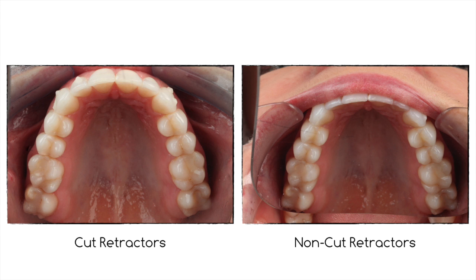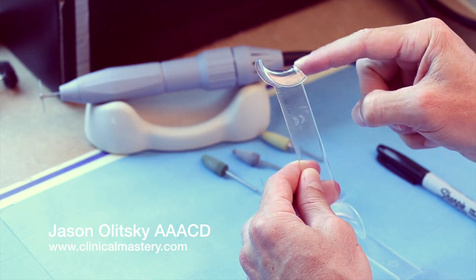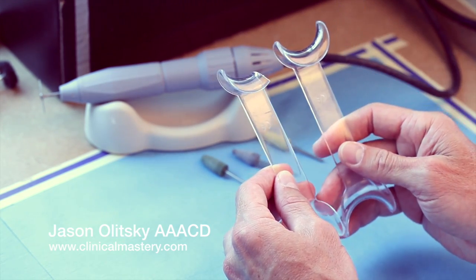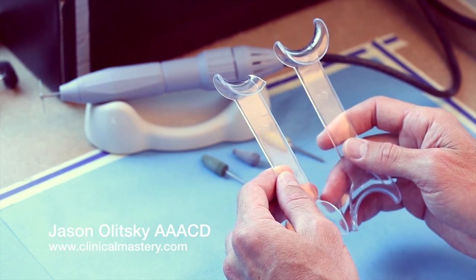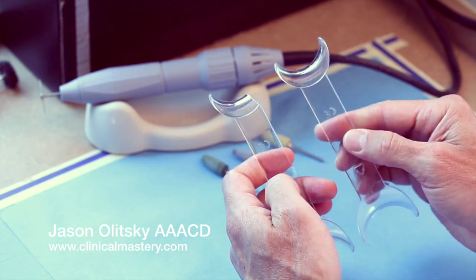This is the way I do it. I have one cut already — you'll see one arm has been cut off. I'm going to do another retractor so that there will be a set. You have to make sure that you cut the right side; you don't want to cut the same side on both retractors because then you wouldn't be able to use them.